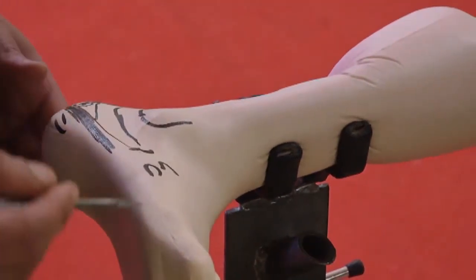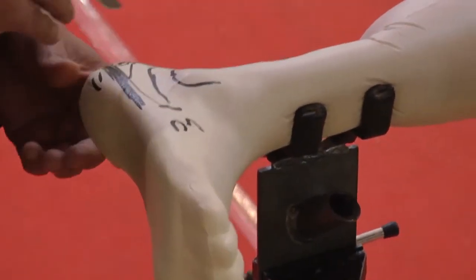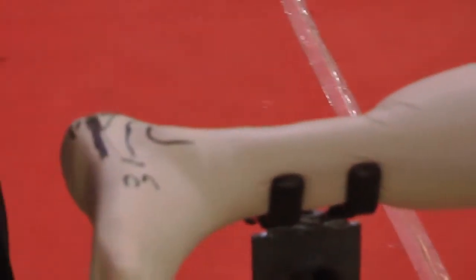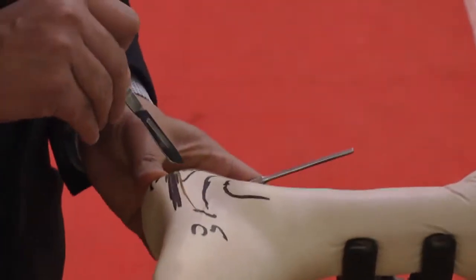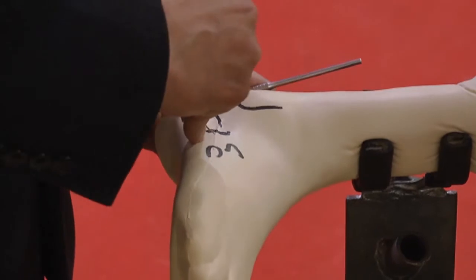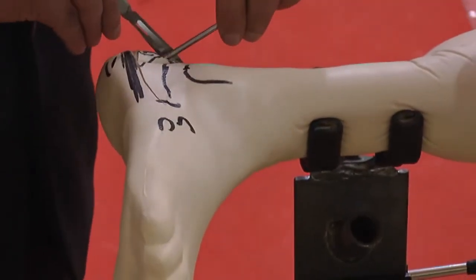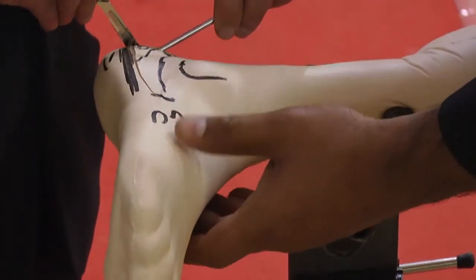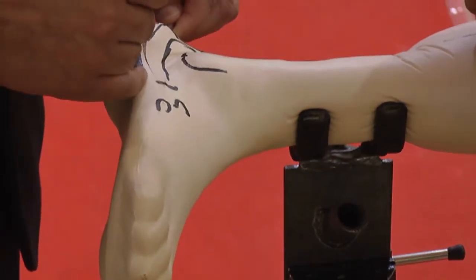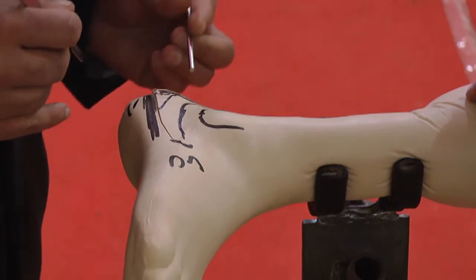So do we have a forceps? We don't have forceps, and possibly we don't have retractors. So I'm going to use something or the other. So hopefully, now this is not to be done. But no hooks, no forceps holding the flap. So I'm trying to go deep. I don't have the proper instrumentation to hold the flap there. In an actual situation, I'll use the back of my forceps and not hold the tip of the flap.